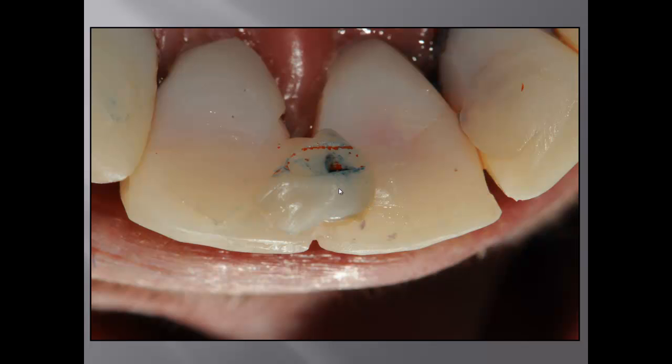So the next step, I'll remove the rest of the temporary crowns, and I'm going to leave only 8 and 9. First we'll take the final impressions. This is for a repeatable bite, so we can have cross-arch articulation. So I'm going to leave the temporary crowns 8 and 9 with this bite. For the bite registration material on the missing teeth, I let the patient bite. I want to make sure the patient bites in the same position.